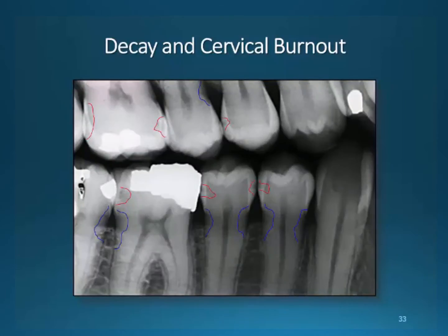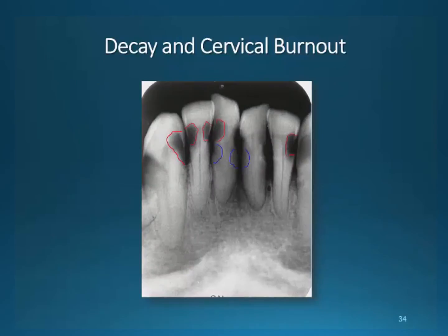Let's take a look at decay and cervical burnout and compare the two. Red areas are decay; blue areas are cervical burnout. We have both rampant decay and cervical burnout in this slide. I have circled the areas in red that are decay and circled the areas in blue that are cervical burnout. There is obviously a great deal of decay, and it is much harder to detect cervical burnout in situations like this. Without a visual exam, we cannot be totally certain that what I have outlined in blue is not the beginning of some area of decay.